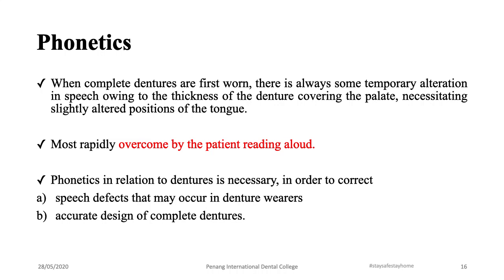So when you give these new dentures, the dentures might be much thicker than the previous one, so he might have problems while speaking. There's no worry, but you can just ask the patient to speak loudly or read a paper loudly for a week, and then the patient gets accustomed to your new dentures, and then his speech rectifies by itself. Phonetics in relation to dentures is necessary in order to correct speech defects that may occur in denture wearers. Accurate design of complete dentures.